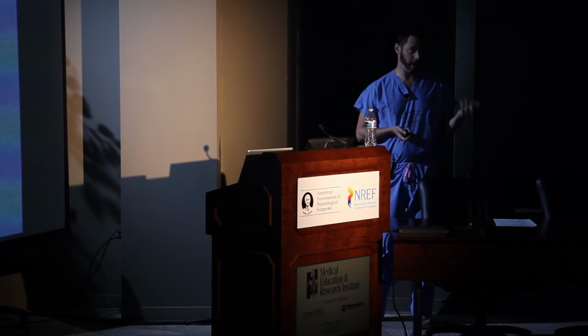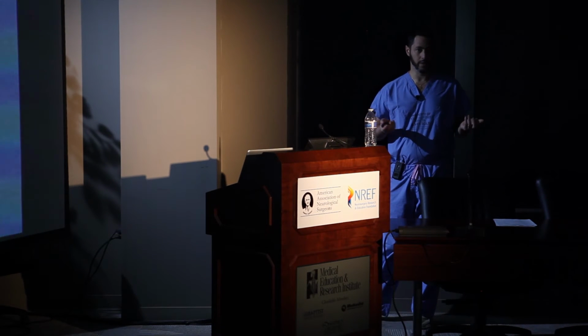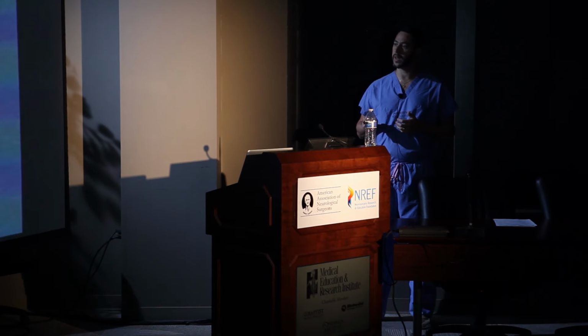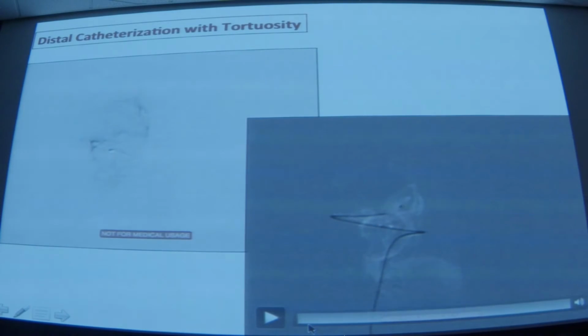So one thing I would recommend, and you can do this in any vascular tree, in the external carotid, catheterizing an aneurysm, if you can, lead with the microcatheter without the wire out. Sometimes you can get away with that, and in my mind that's safer. So we're already very distal, 180 turn, 180 turn, and then you can see what this Magic microcatheter is able to do if you just push it without the wire.